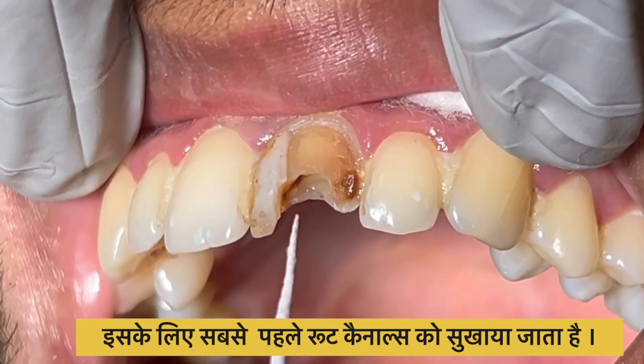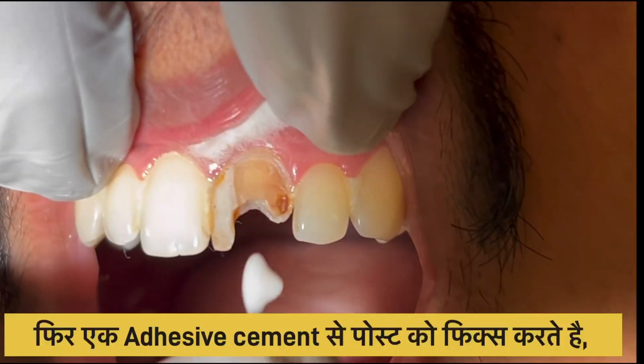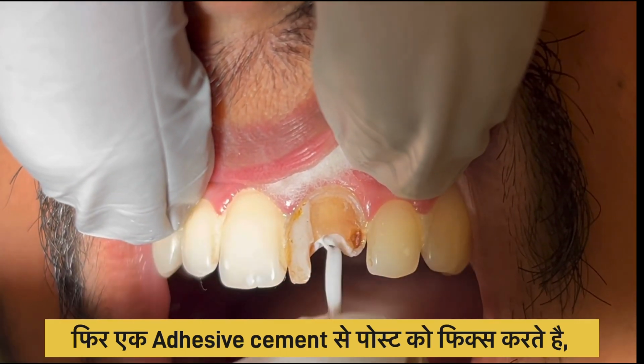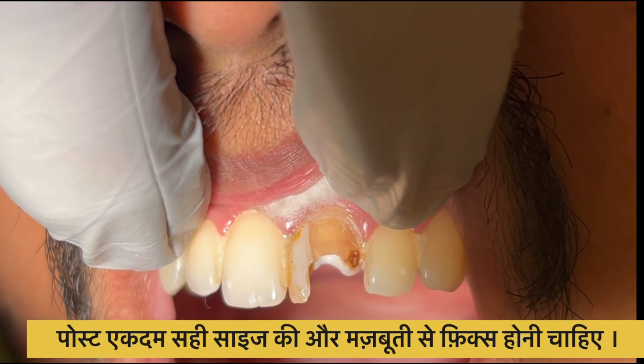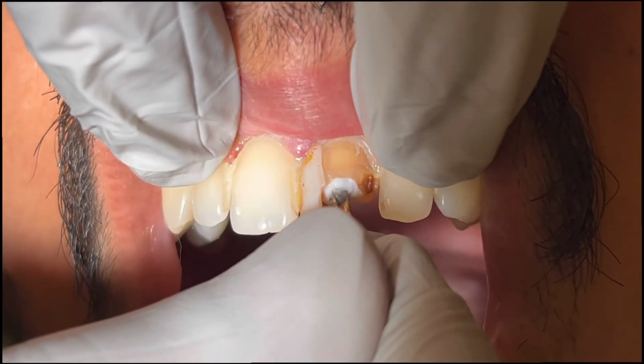First, the root canals are dried up, then the post is fixed with the help of an adhesive material. After that, the tooth is built up, which should be done using standard material only, and gradually the tooth starts to take its original shape. Selecting a post of the correct quality, size and shape is also very important. Only then will the long-term results be good.